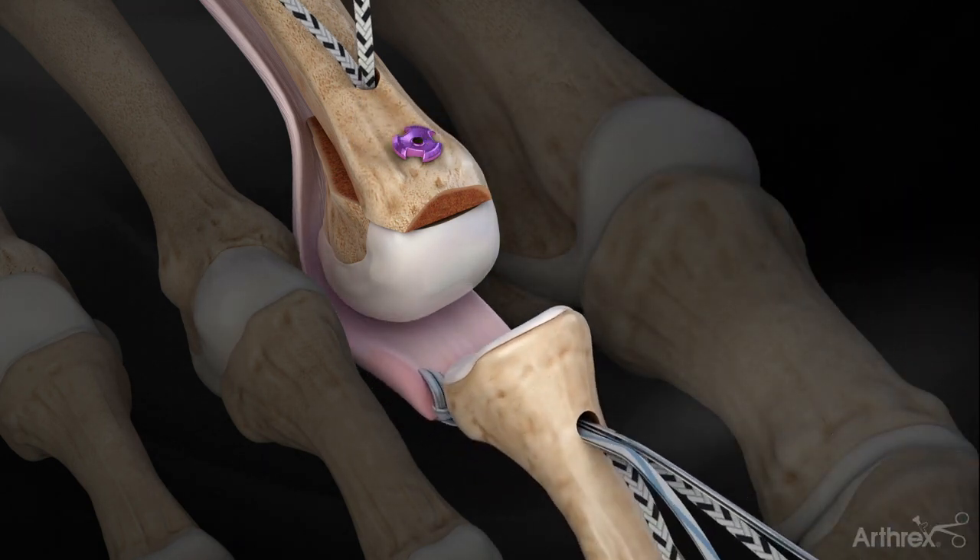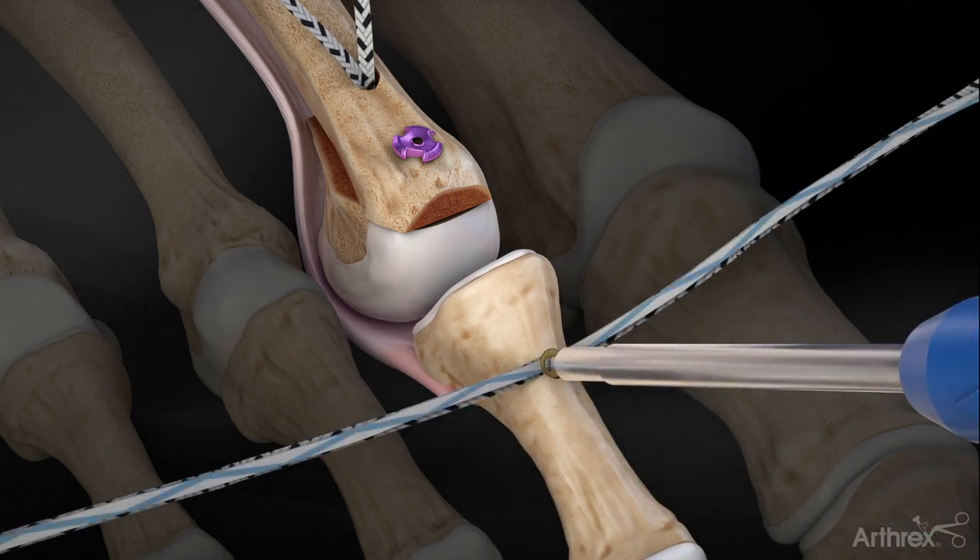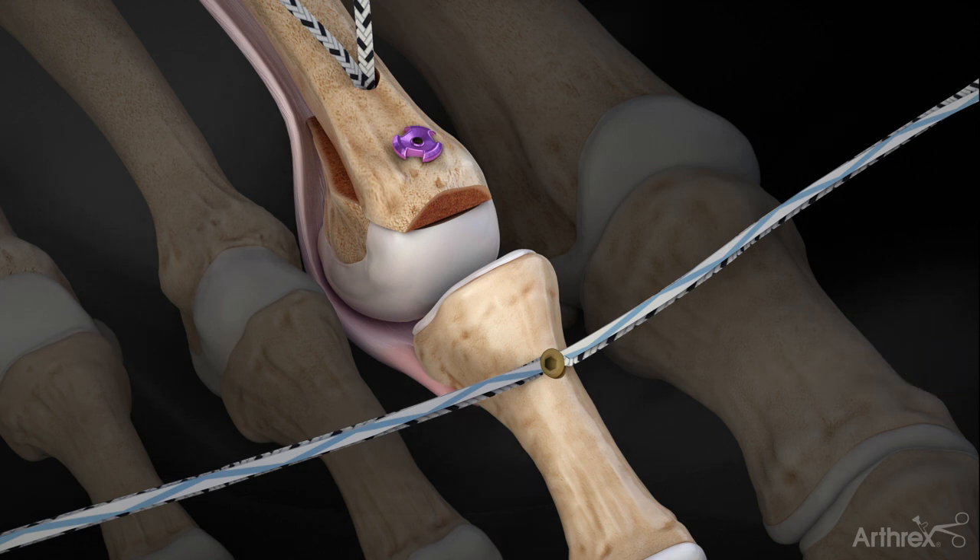Now, implant the 3 mm by 8 mm peak tenodesis screw into the proximal phalanx, spreading both the labral tape and suture tape sutures and putting the screw in between.